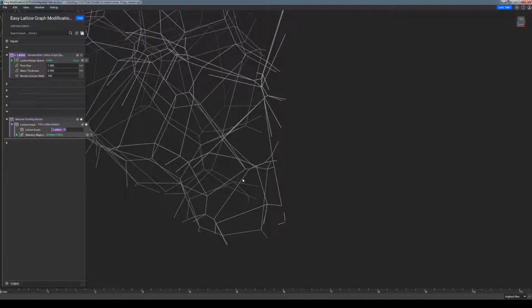However, it is important to note that if these two beams were connected to each other, they would not be considered floating and would not be removed using this block. In this circumstance, removing these two floaters would require a slightly different approach, perhaps using Remove Open Beams again, or perhaps more manually using the Remove Selected Beams block.